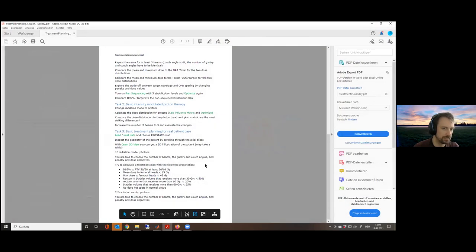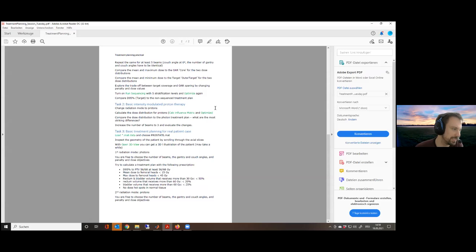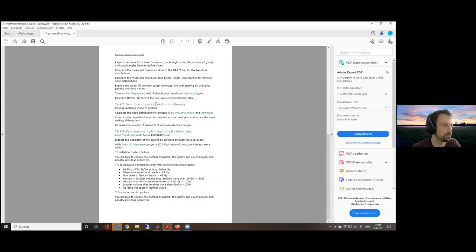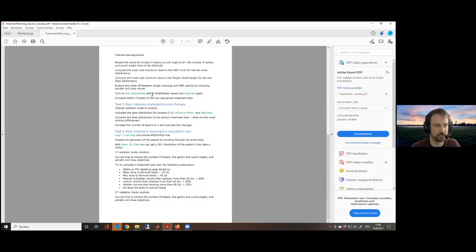The result is already closer to the ideal dose distribution. The target is covered and the core is actually spared quite nicely. Five beams create some geometric artifacts — it's not a very smooth round shape — but we are approaching the ideal distribution. With nine beams you'd probably get even better coverage. There are some input errors reported — the error using 'vertcat' is probably something with how the beam angles were input. Put a space between beam angles, no semicolons.